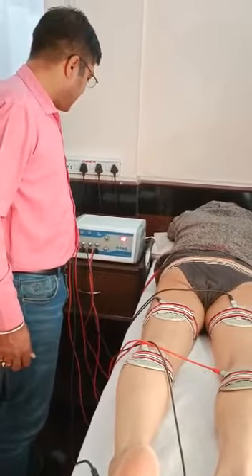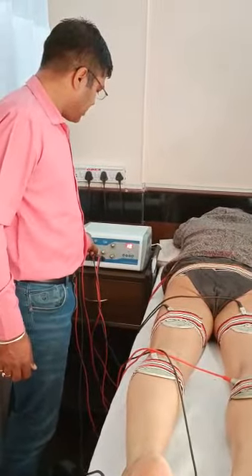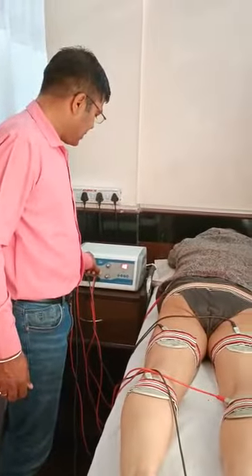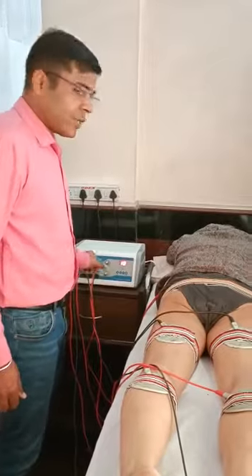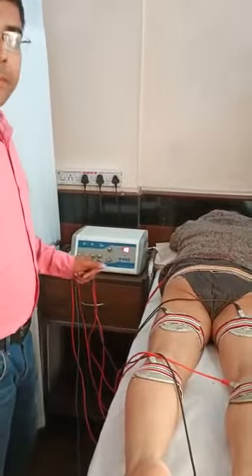It should be very gentle, otherwise the patient will feel a shock. You have to be very gentle with it. Slowly we are increasing the intensity. Is it comfortable, sir? It will feel a mild tingling sensation. In any kind of nerve pain, this is very useful and helpful. Thank you.